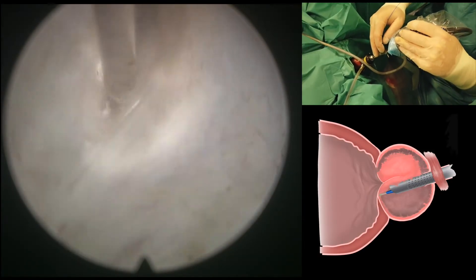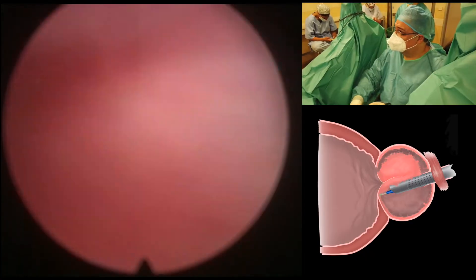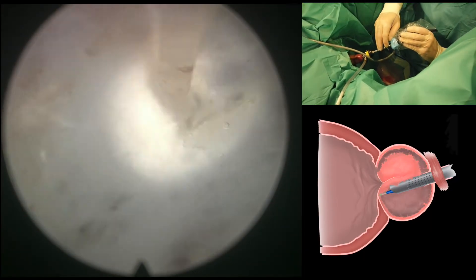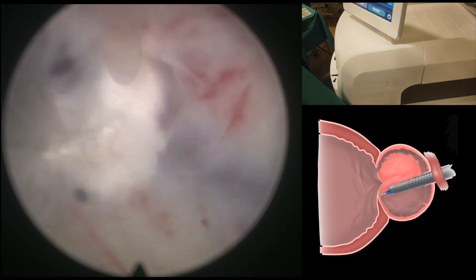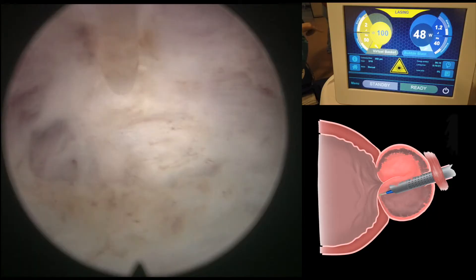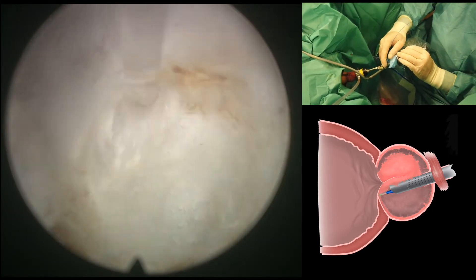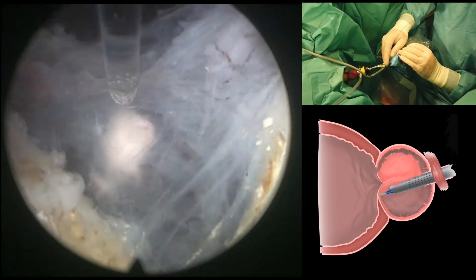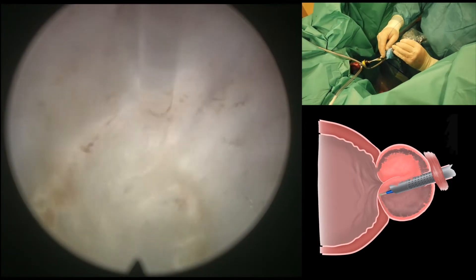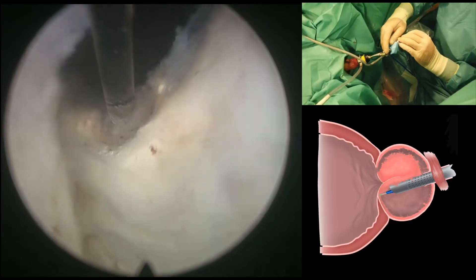All the anterior aspect of the prostate has been liberated and we are now cutting the bladder neck circumferentially. Here you can see how the camera and scope have to look towards the line of dissection. We can judge the depth of the dissection — if we're going too deep we can correct by approximating the fiber and targeting the laser closer to the adenoma, and if we are leaving tissue behind we can go a little bit more lateral. Typically the adenoma looks a little bit more yellow than the capsule, which looks whiter. When we get to the bladder neck incision we have to check the ureteral orifice to avoid damaging it, and carefully the energy is used to dissect the anatomical plane.